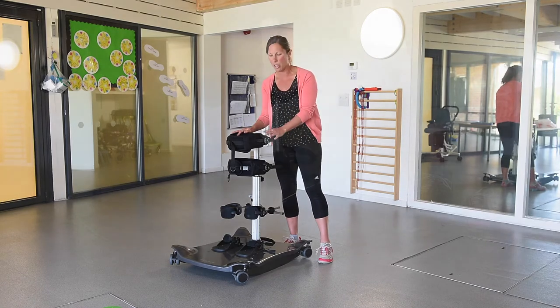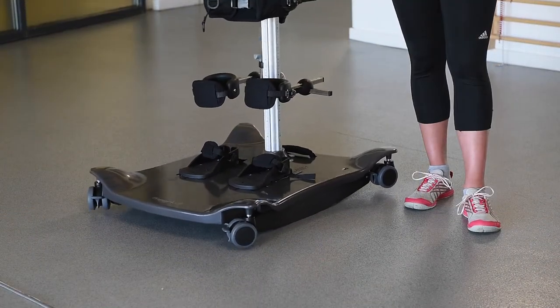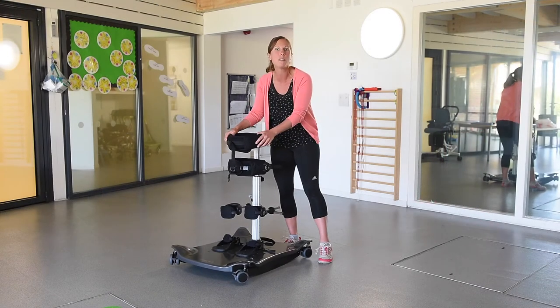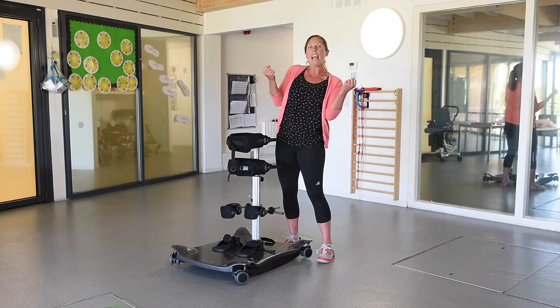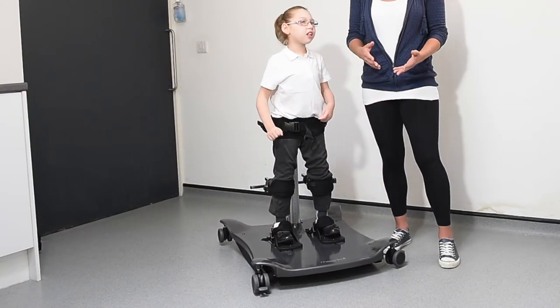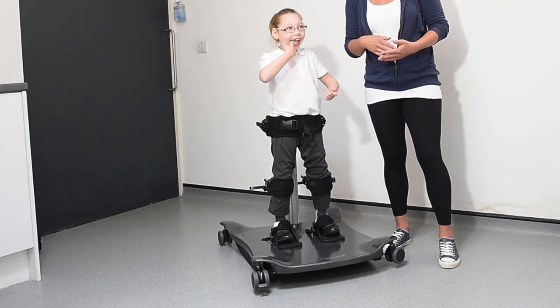Then we're introducing the rocker, so we're starting to get it a little bit dynamic. Initially we're just letting the child get used to that movement. Some kids were holding on to bits of support or moving outside their base and fixing. We're just getting some highlight activities and allowing them to get used to that feeling of instability that was happening with the rocker.